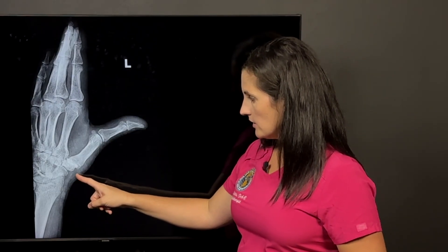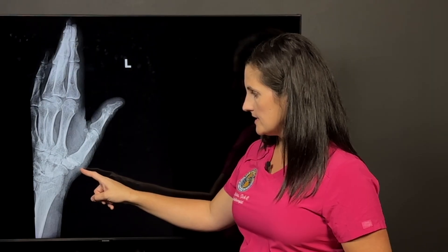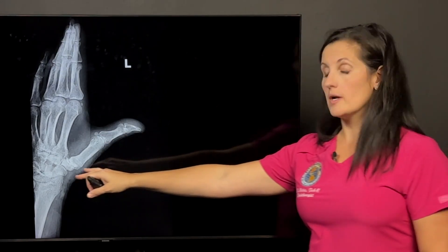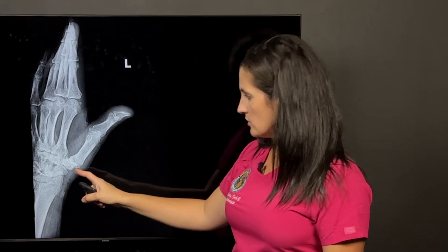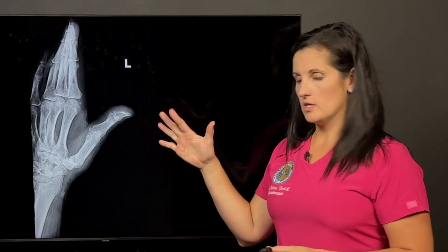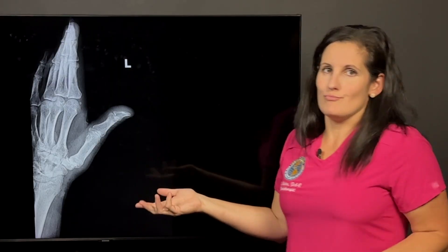If we look here, you can see how it shifts and then comes back up. As he comes down, it shifts down a little bit and comes right back up. Yes, the joint is arthritic — we can see that. He's reduced the space there and he's starting to get some bone spurs, but only in this motion component can we actually see that it's moving too much.